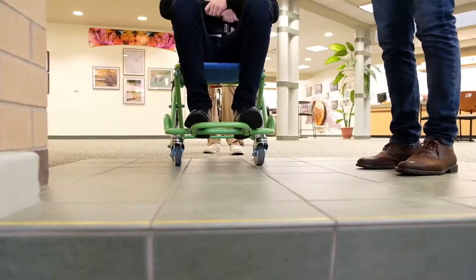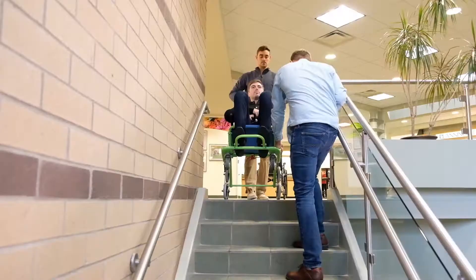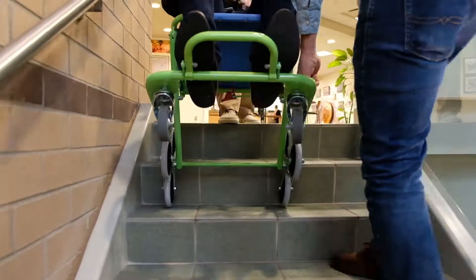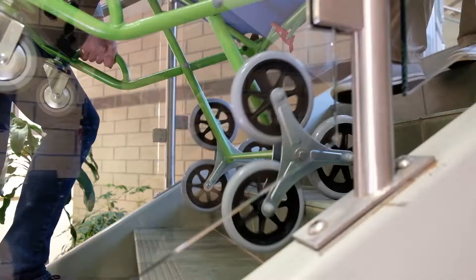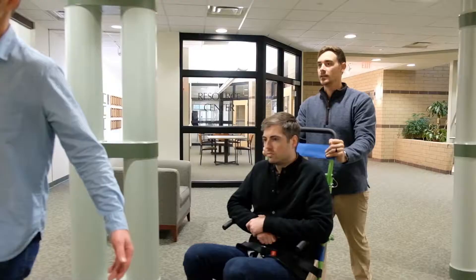Once at the stairs, one person should hold the handle at the rear of the chair and one or two people should hold the lifting handles at the bottom of the chair. Maneuver the chair slowly and confidently over and either up or down each step of the stairs. Once on the stair landing, lower the chair into a static position and prepare for the next flight of stairs. When you get to the ground floor, maneuver to the final exit.